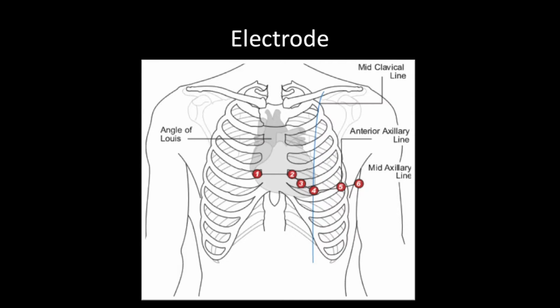So I'm going to go in the mid-clavicular line, in the fifth intercostal space, and boom, I place a sticker. Forget the nipple. The nipple has no impact on any of this, right? The problem is, in some people, the nipple would be here, here, here, or I don't want to say it. Never mind, I don't want to get in trouble. Non-existent. But the nipple could be in a different place. Do not use the nipple as a landmark for anything, just forget about it, it's there.